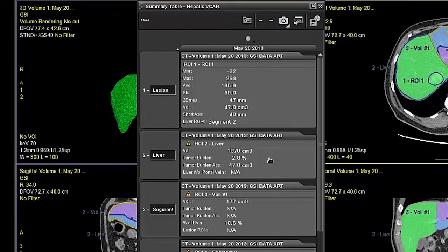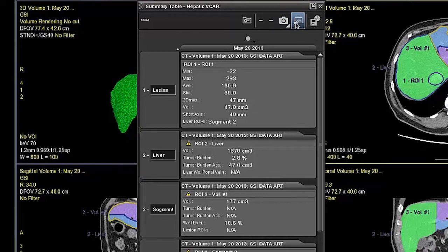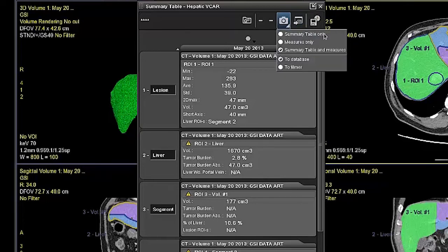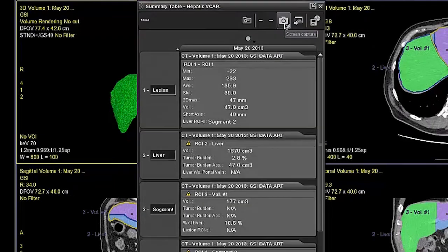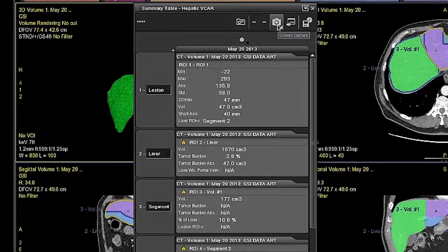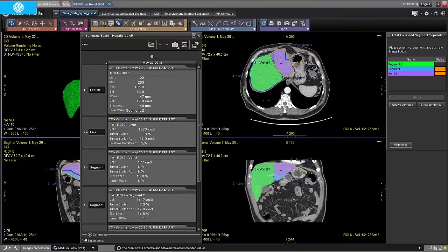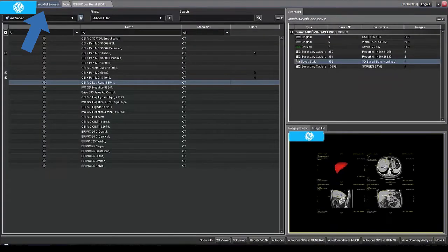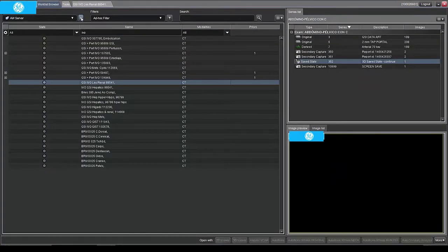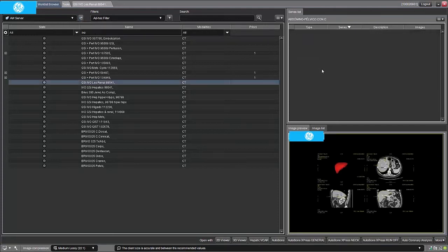To save results from the summary table, we can select between the format of a screen capture or a comma separated value data file. Under screen capture we can select the type of screen capture and the destination. Once saved, it will be available as a new series in the patient folder. Remember to refresh the worklist browser so that the new reports will be shown.